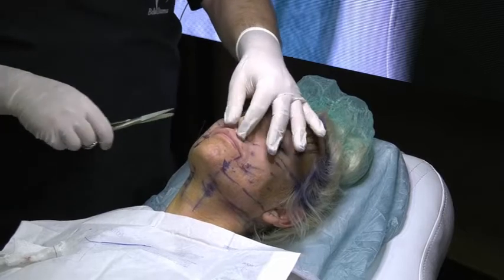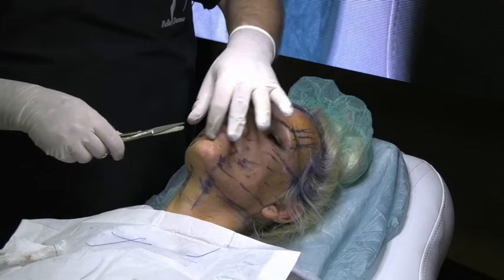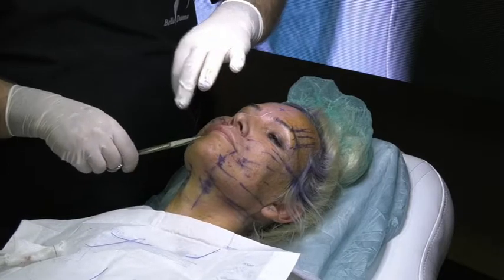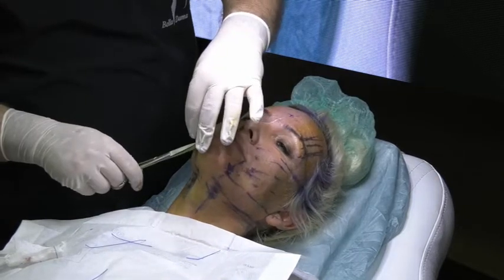Okay, same story. Hold, press down and cut. You see all this dimple? It's very easy to go. Look, softly, softly it will go.